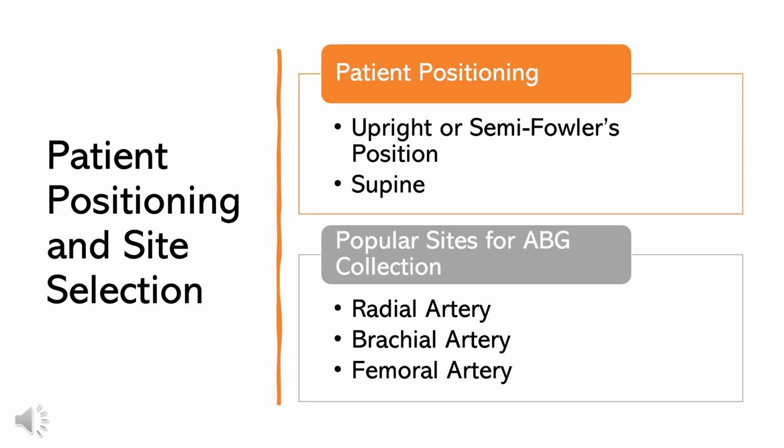Provide the healthcare provider with needed supplies and assist in positioning the patient's wrist for ease of access to the radial artery. Observe the Allen's test, as we discussed, for adequacy of collateral circulation. We might need to use a brachial artery. If the radial site isn't viable, assist the healthcare provider in accessing the brachial artery.